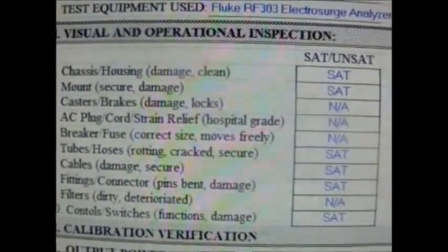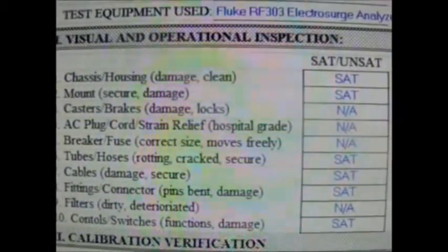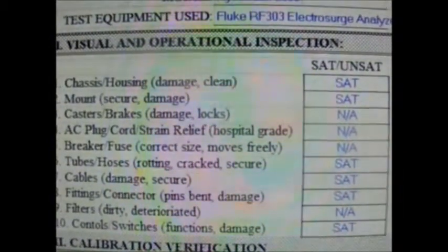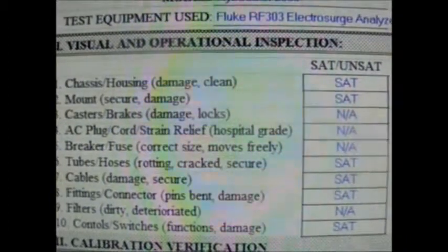Here are some visual and operational inspections: inspections on chassis and housing, mounts, AC plug, check breaker fuses, cables, fittings, and control switches.